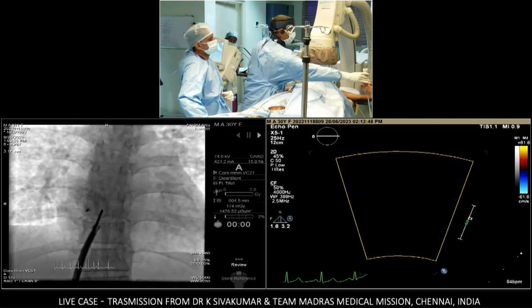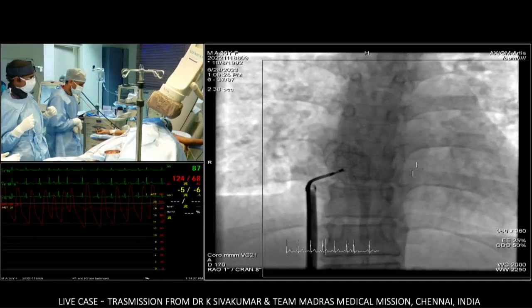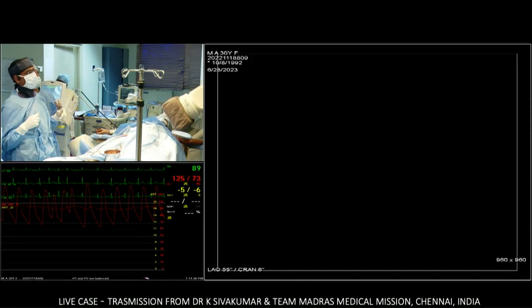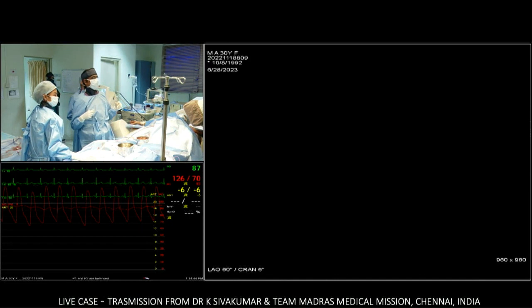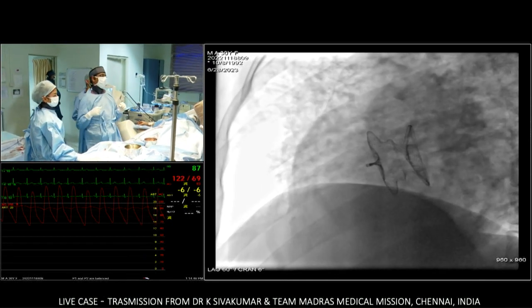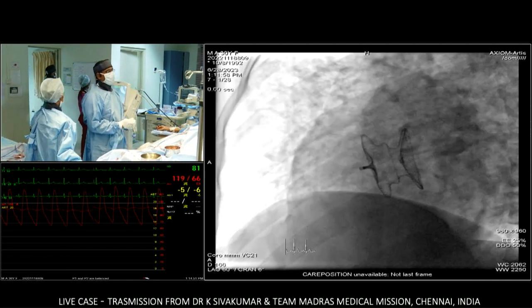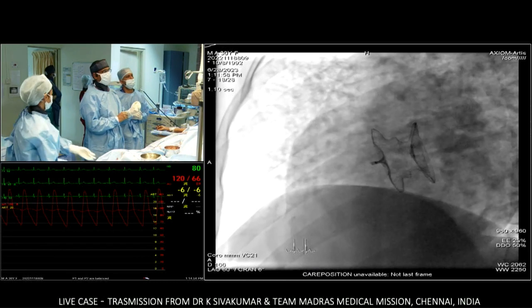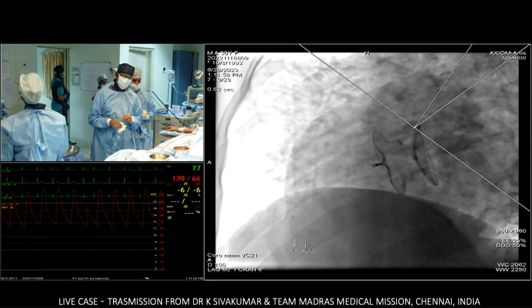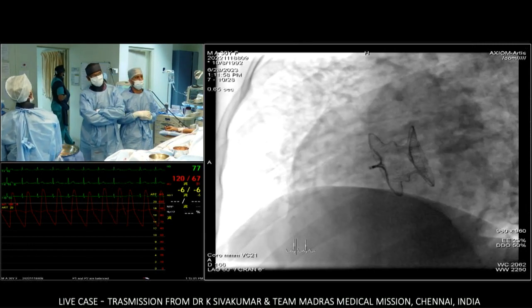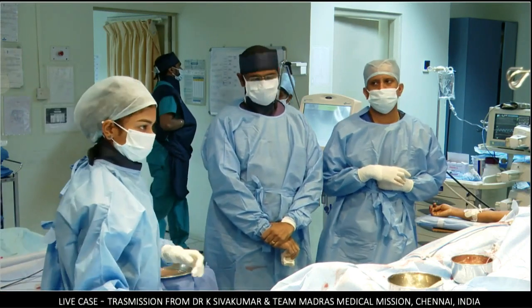On the final LAO fluoroscopy view, the device profile is shown. The x-ray shows a bigger profile than the echo, but the device is confirmed to be flat. This matches images shared from Vietnam. The case is concluded with appreciation for an excellent demonstration of the first-in-India use of the HeartEx ASD closure device.